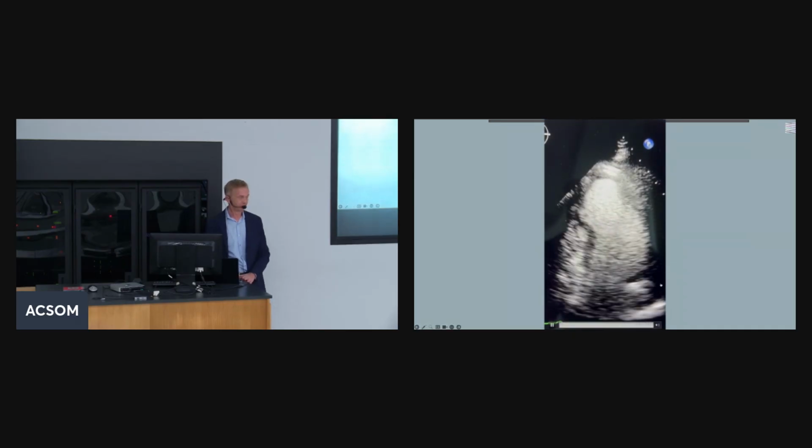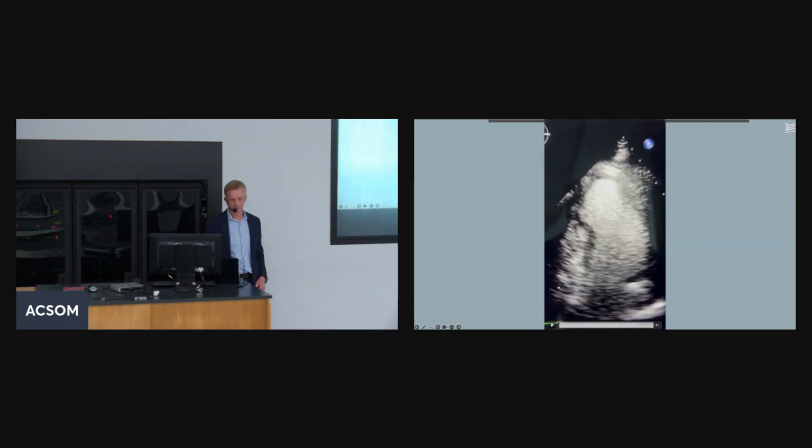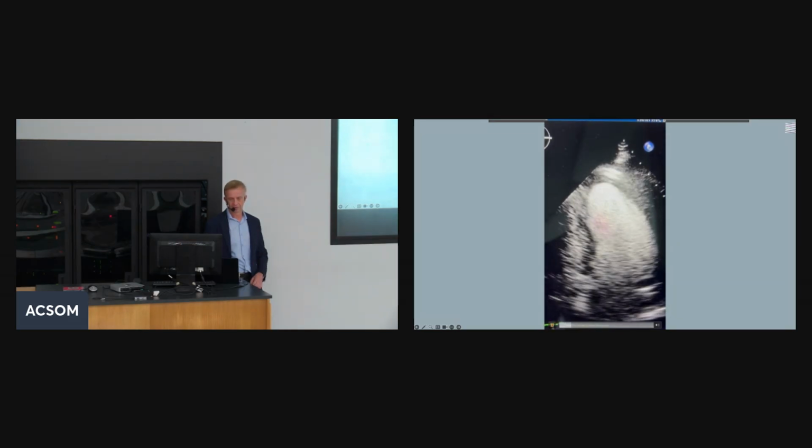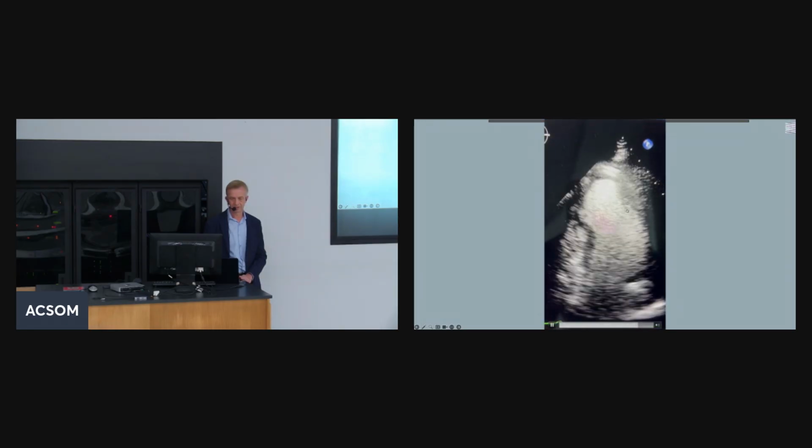So this is the left ventricle. You don't see the atria; they are down here. The probe is here. So we are talking about the left ventricle. This is one of the views of the left ventricle, a two-dimensional view. So you see the heart is squeezing here, the walls here.